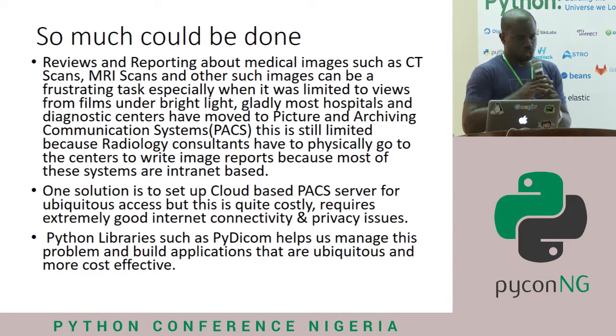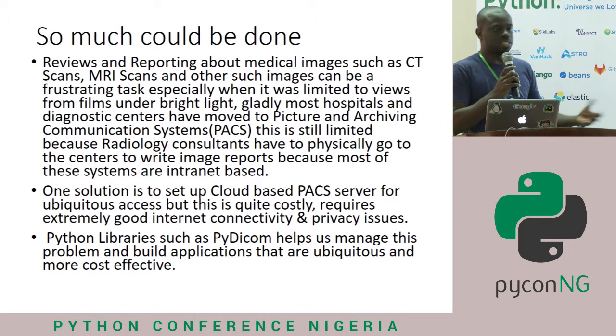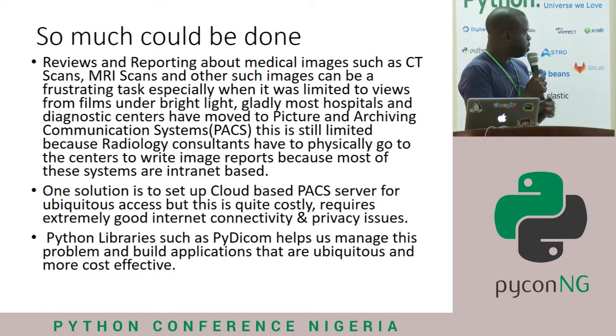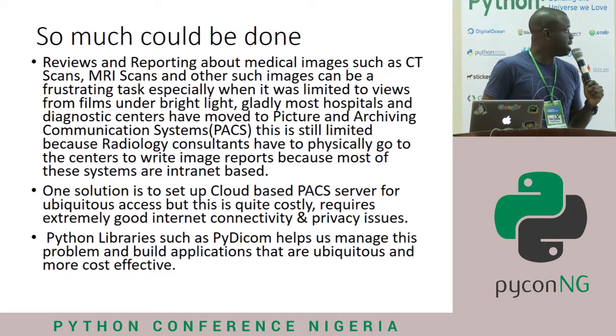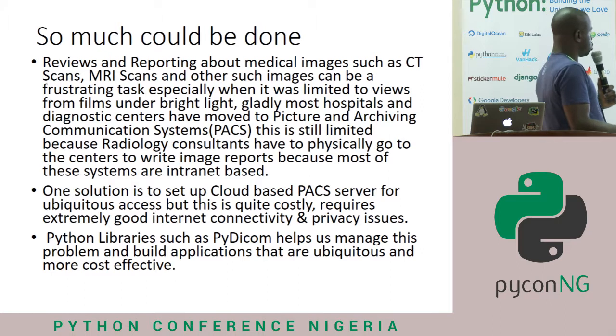Then there is DICOMweb, which is a standard for web-based medical imaging, and it's a set of RESTful services that enable web developers to unlock the power of healthcare images using standard industry tool sets. So much could be done.